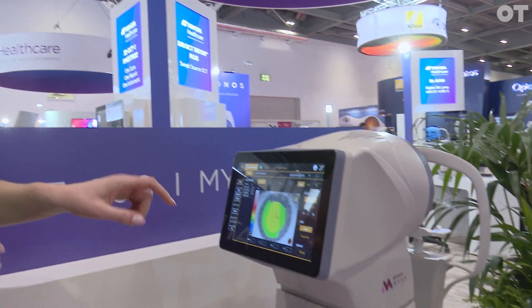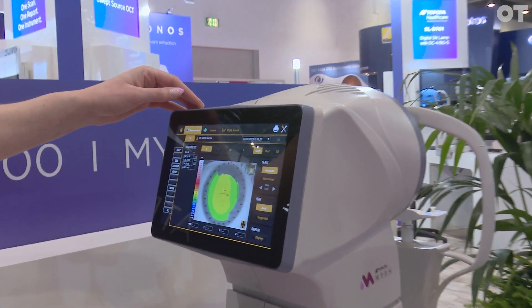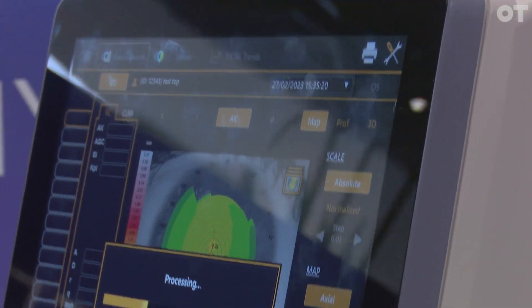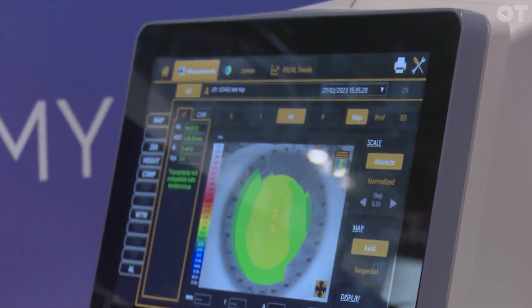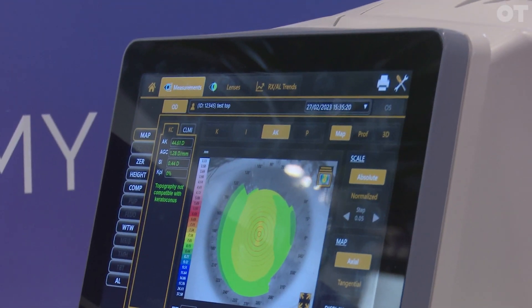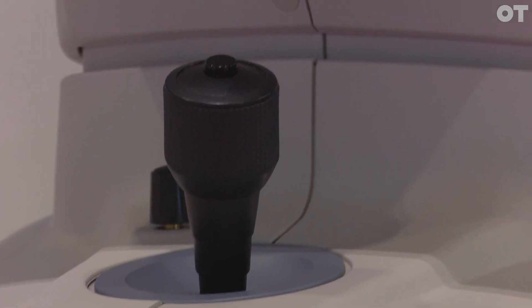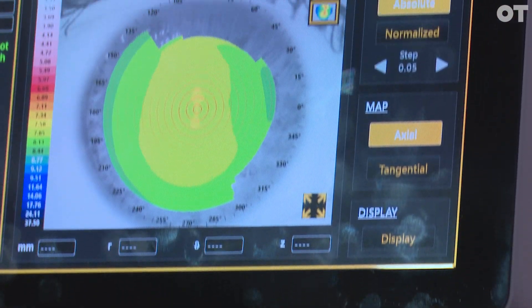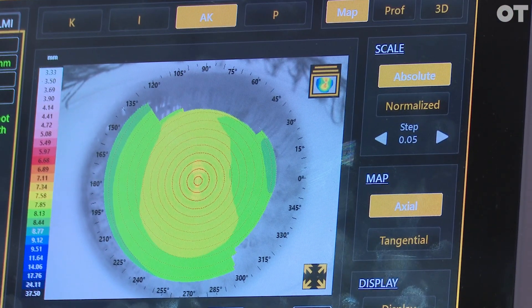When we've done that initial capture with the topography and biometry, we get six axial length measurements that are averaged out so we can get a really repeatable measurement. We then get data relating to the keratometry and a screening for keratoconus as well, so we can ensure that patients are entering the correct pathway. We're also able to do a pupillometry assessment to check pupil size under different lighting conditions.